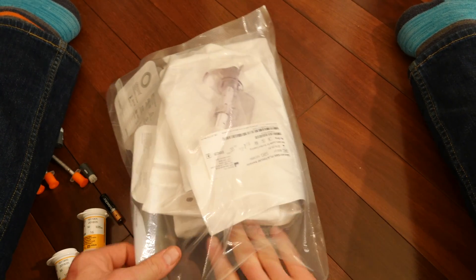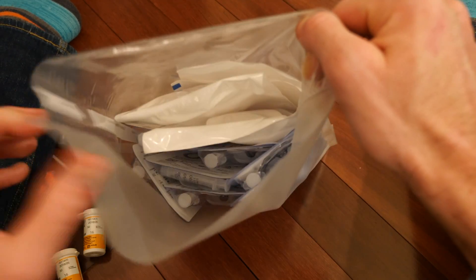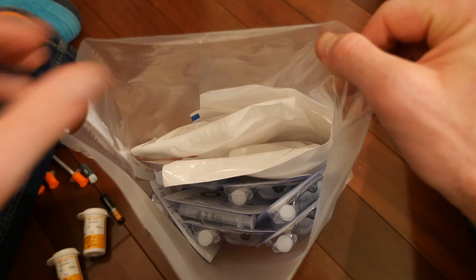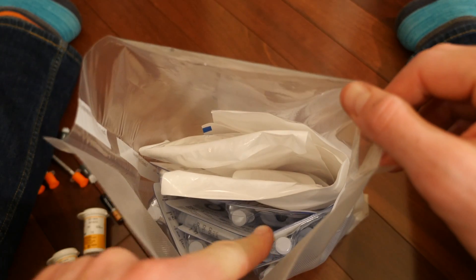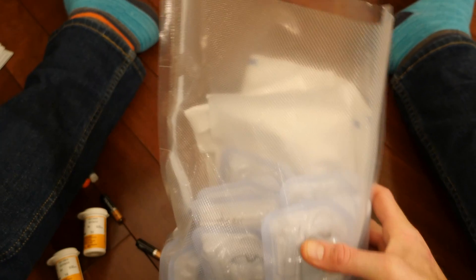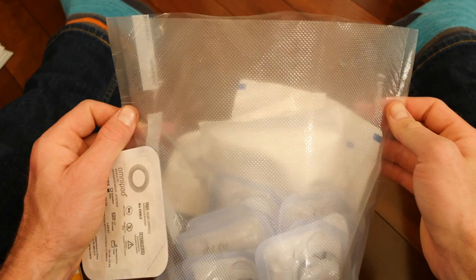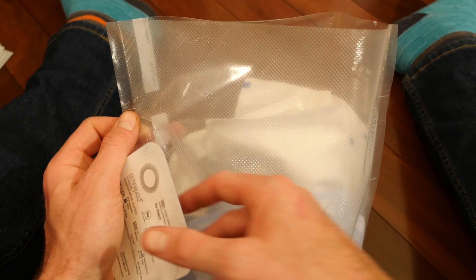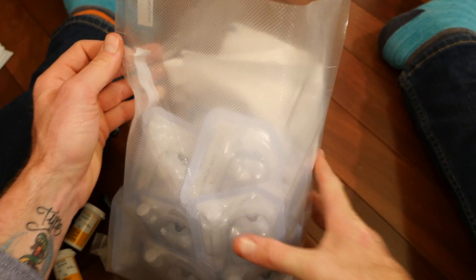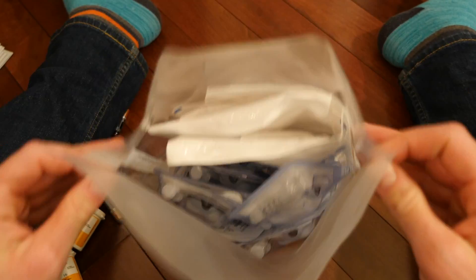Nothing too crazy, you don't want to be too forceful. Right now this is what we're working with — it's kind of a hot mess but that's okay, because we can fit everything else in around all those little nooks and crannies. I still have two more pods to get in there, and as you can see we still have plenty of space between the top of the bag and where the last pods are. All these pods are facing the same way because that's how they stack best.